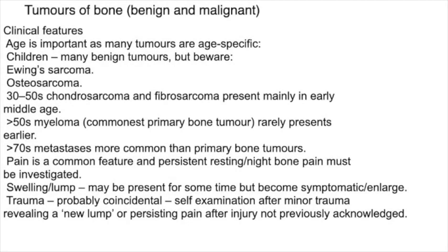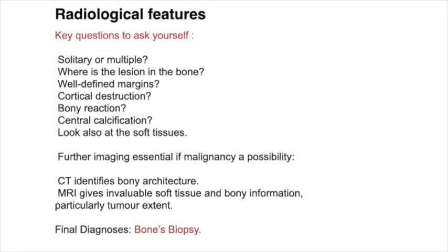So let's talk now about tumors, benign and malignant tumors. These are the clinical features of the tumor. There are more clinical features you have to know when you arrive at, I think, your 5th year in your career. But in this case, we are talking about X-rays. So let's focus on X-rays.